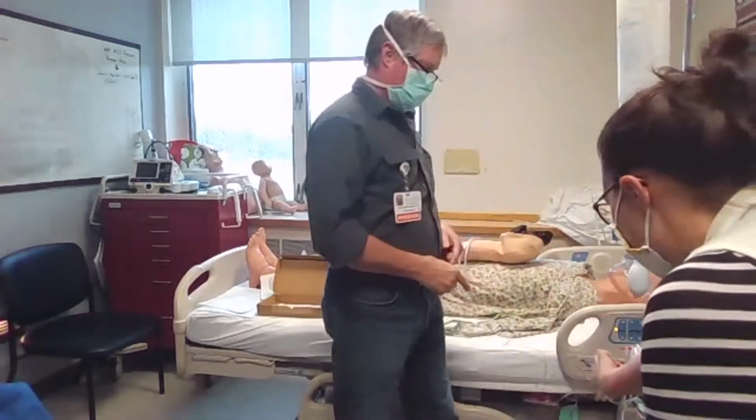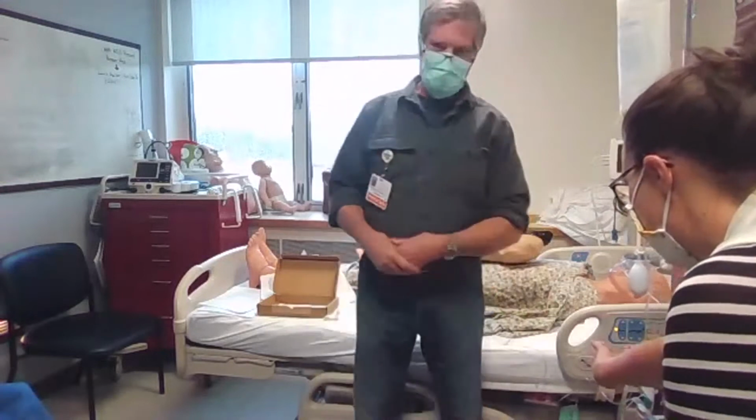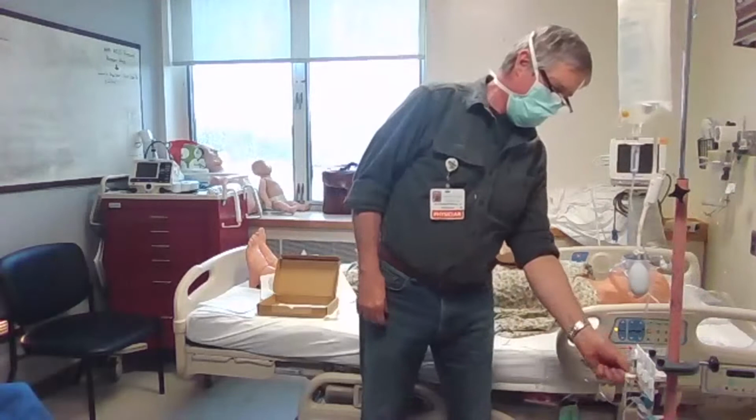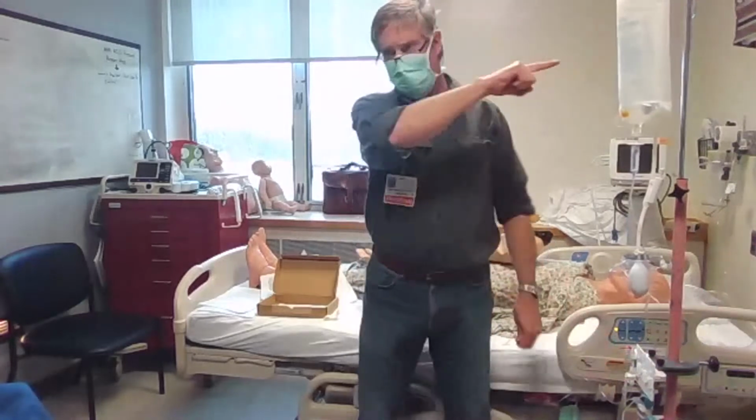And that's by turning it off to the patient versus zeroing on the monitor. So I'm going to show you. Off to the patient, open the cap, hit 0 on the monitor.